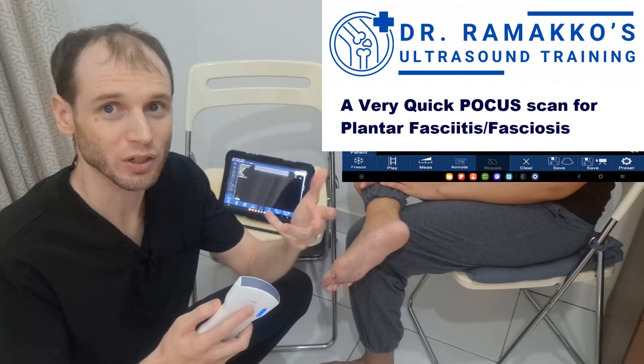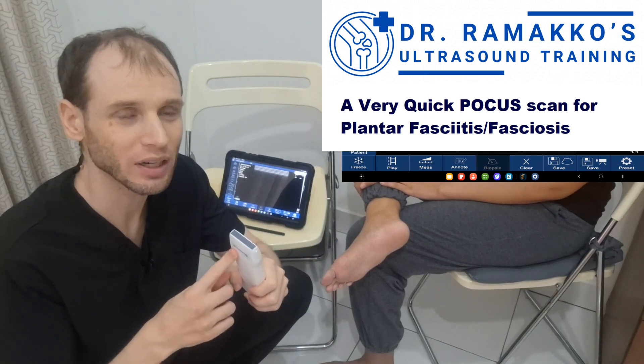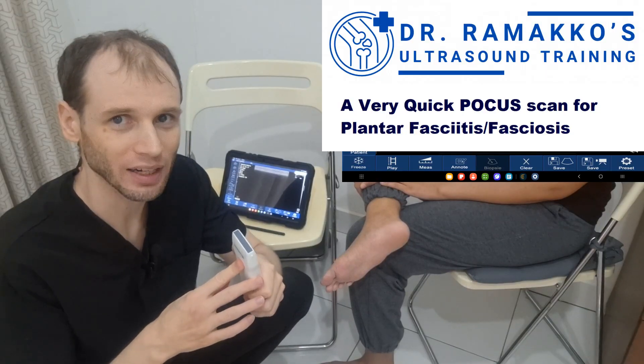In theory the structure is quite shallow, so higher frequency should be better for higher resolution. I think I'm going to use 7.5 megahertz for this today.